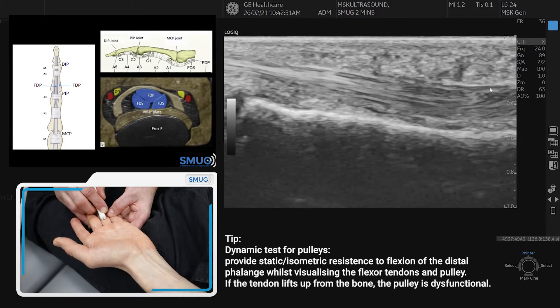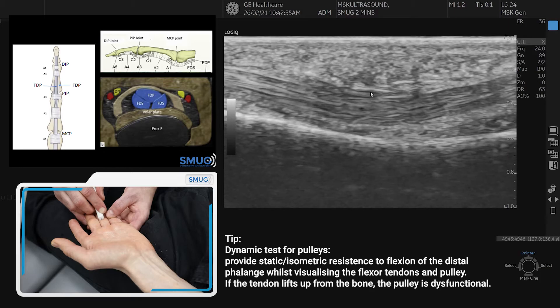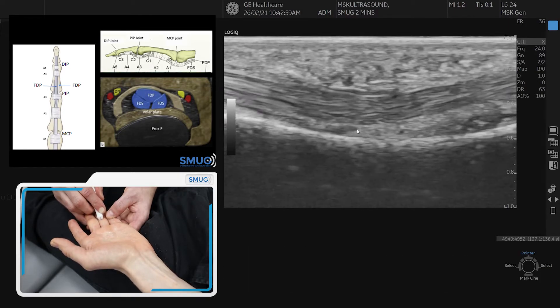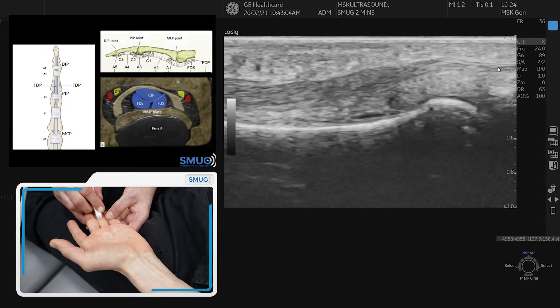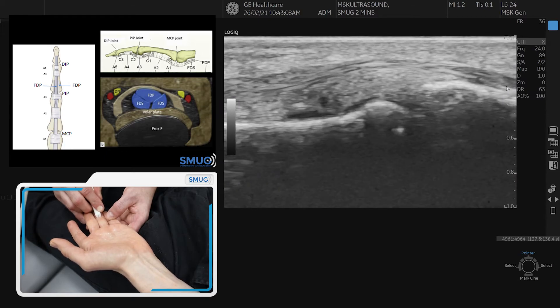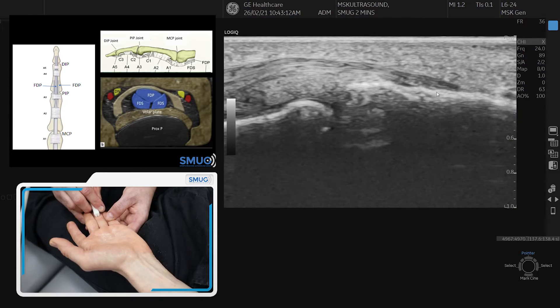Here's the next pulley coming into view. Again you can see how nicely it keeps the tendon tight against the bone — that's the normal appearance. Then you can follow it through; it gets thinner. There's the profundus coming through, reaching the distal interphalangeal joint, and you can see it going into the bone on the distal part — and that's it.